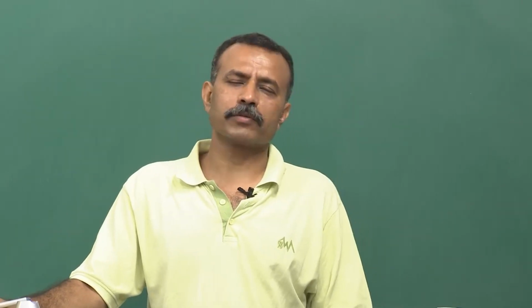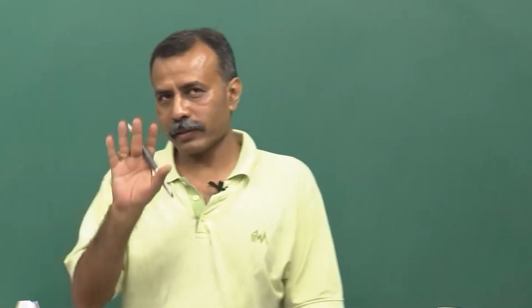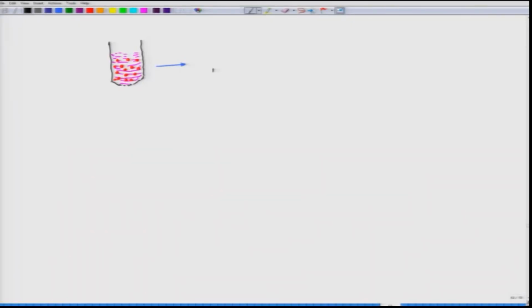I will come to other substrates which are even much more preferred than poly D lysine, but at this stage just keep that in mind. So, here is your cover slip, and here you put medium in which they will grow.